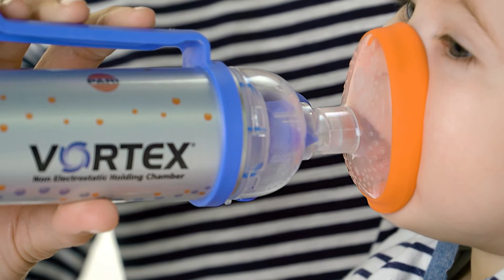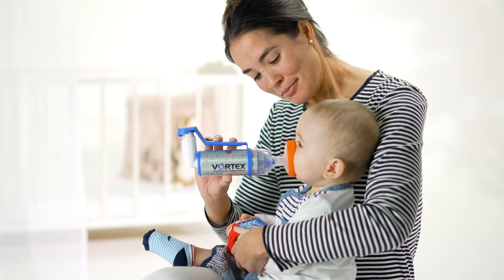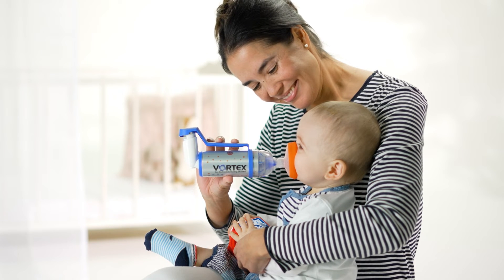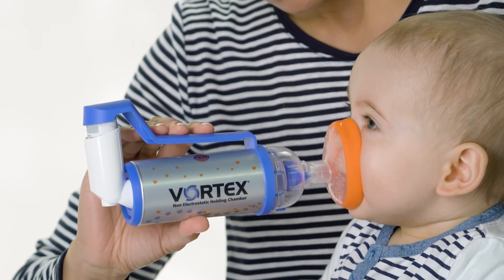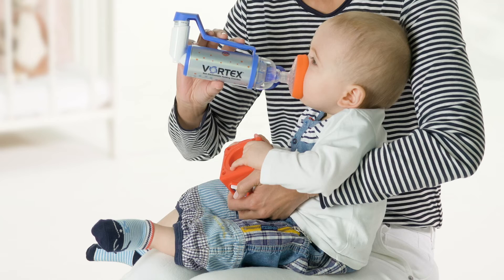The ergonomic mask should be fitted snug to the face of the baby or child and should cover both the nose and mouth. The soft edge of the mask is shaped to fit the contours of the face and allows comfortable inhalation. Hold the one-handed operation aid with your whole hand and trigger the dose inhaler by pressing down on it.